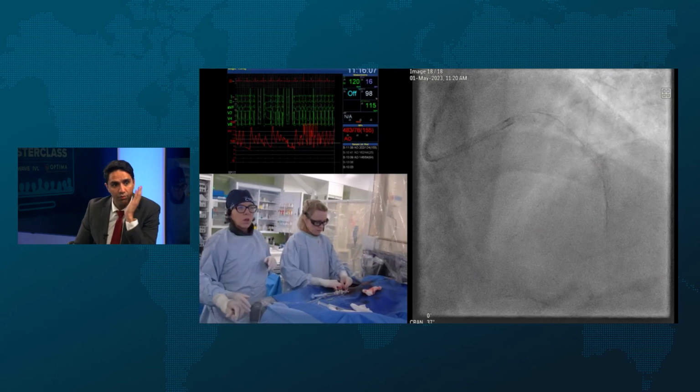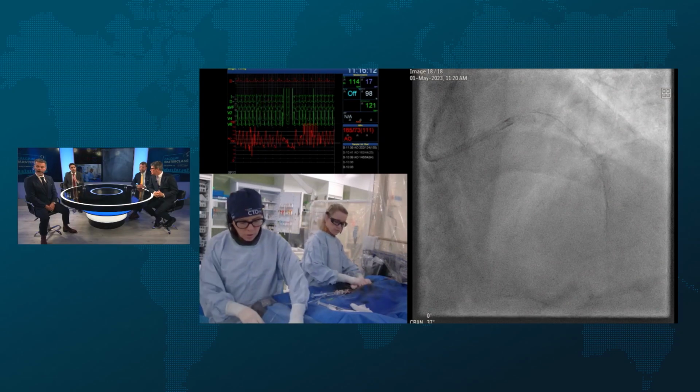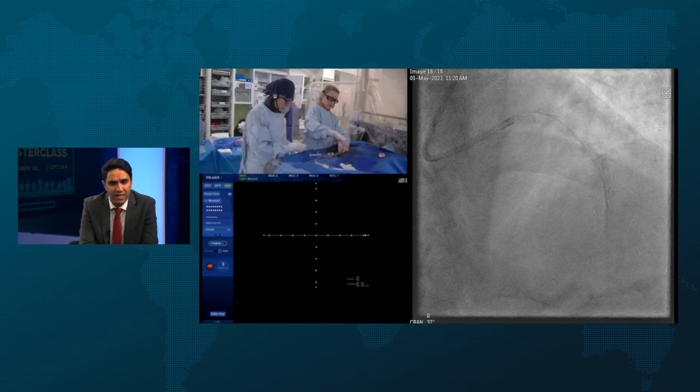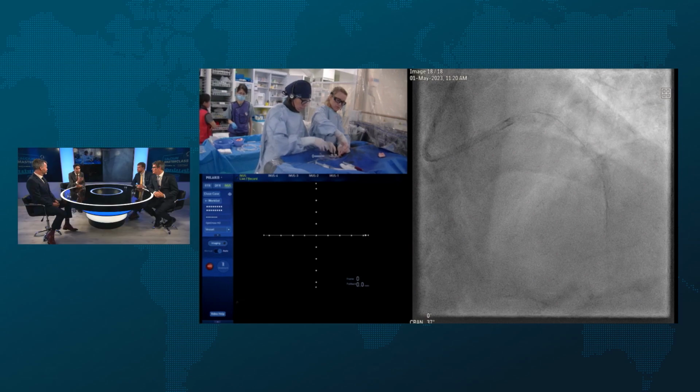What's been the experience with imaging with these? What's the sort of deep OCT system? Yeah, I mean, it's preliminary. We've done 25 cases. SpectraWave is now FDA approved. Exquisite image quality. 1.1 second pullback for 10 centimeters, right? So it really revolutionizes saline guided PCI rather than using contrast. And if you are going to use contrast, you need 3 or 4 mils because it's a 1 second pullback. And the resolution, I mean, after reviewing 20,000 OCTs, there's stuff on those I don't even know what it is. So it's an exciting time for imaging.